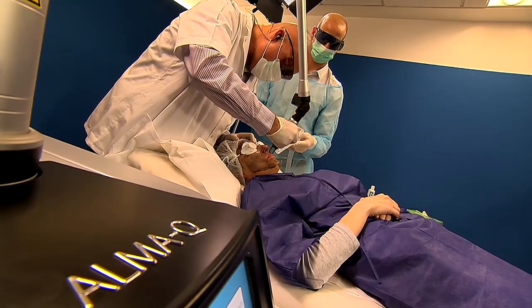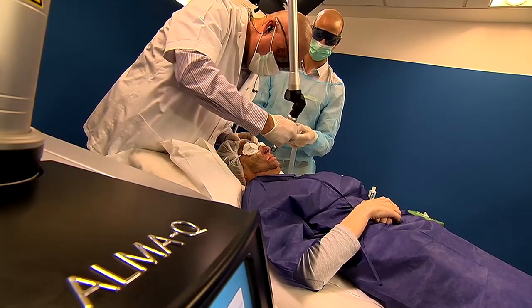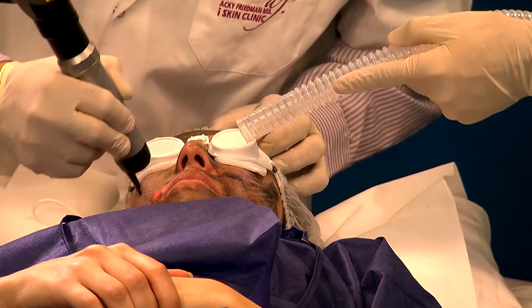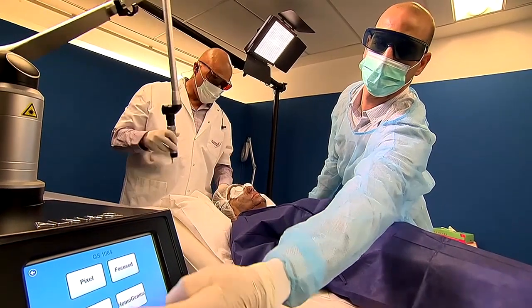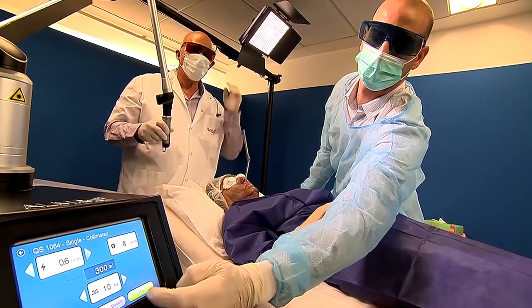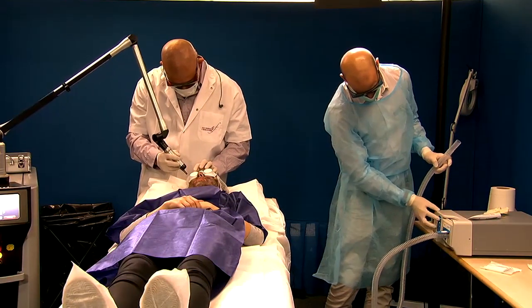Sometimes we might need a little change of energy in the center of the face due to some discomfort that they might experience during the procedure. We use the same handpiece, we just change the settings, and we go again with the collimated handpiece.